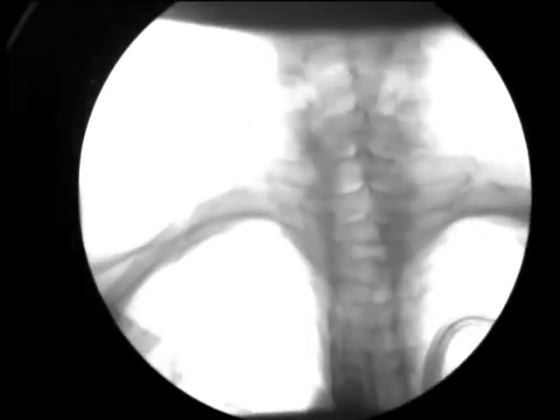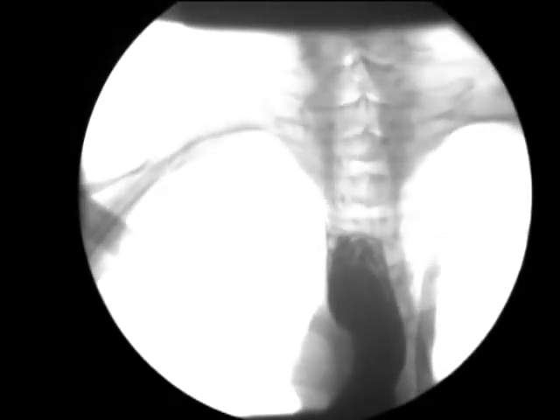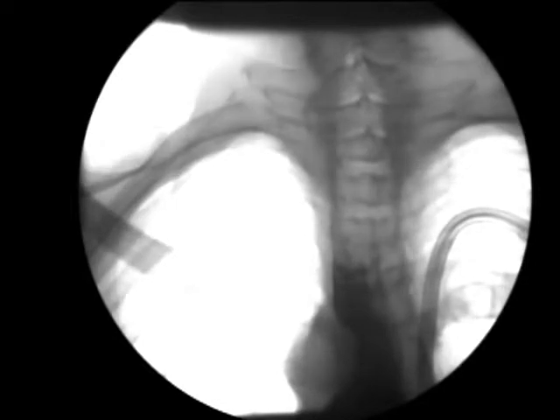That was very timely. But you're going to see that the dye is backing up almost to the collarbone here. And what I want to do is get down low enough to see, is this a narrowing? What's going on here? And as we get to this level, you'll see that there is an absolute blockage. There's nothing in the stomach. It's absolutely empty. This is a patient where you suspect cancer.